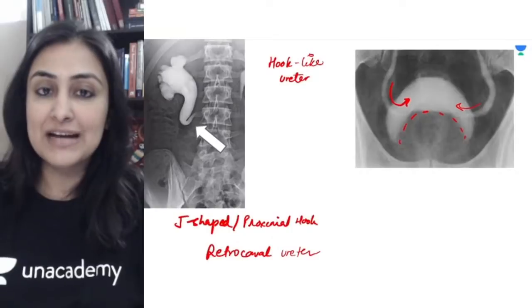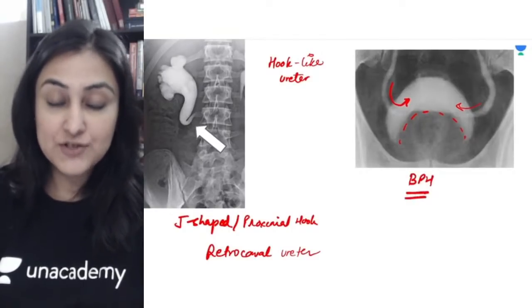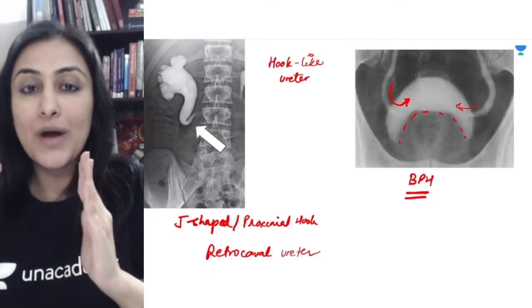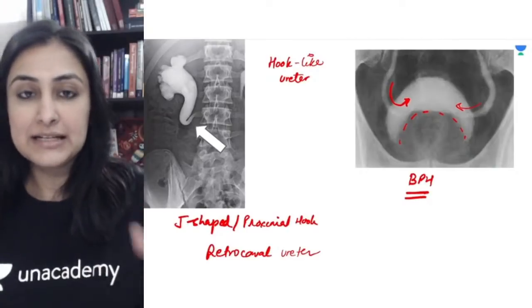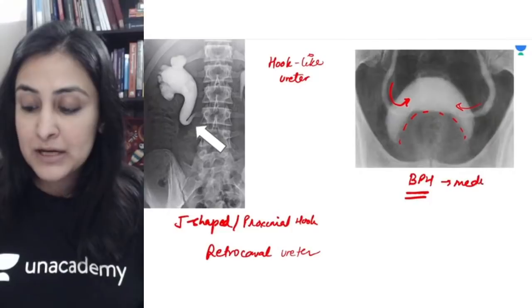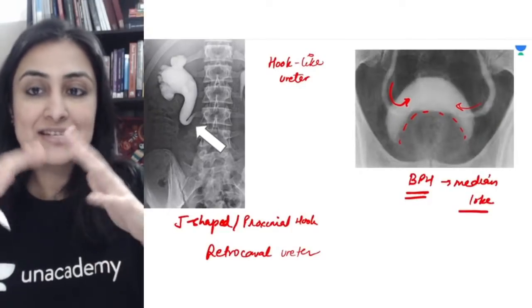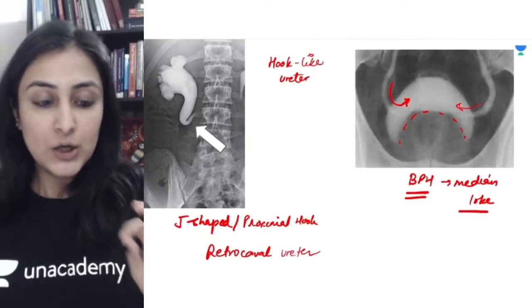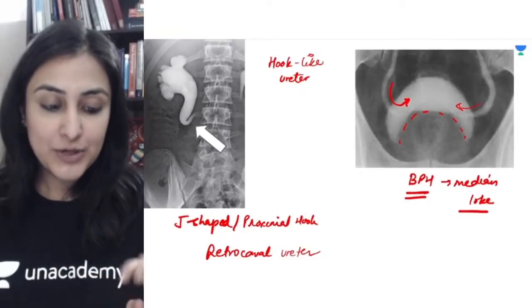On the other hand, when bilaterally both ureters become hook-shaped, more horizontal and more superior, with a filling defect in an older male patient with lower urinary tract symptoms — this is because of BPH. Both ureters now have to go more superiorly, forming this hook-like projection because of the median lobe projecting, also called the uvula, which forms this filling defect over the bladder.